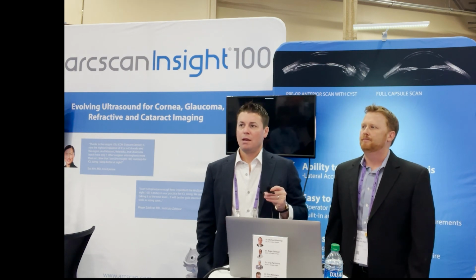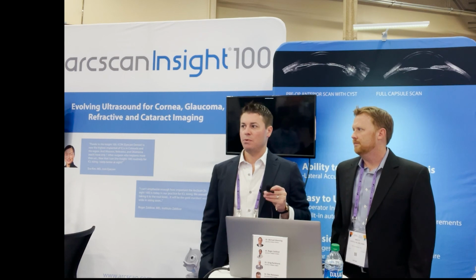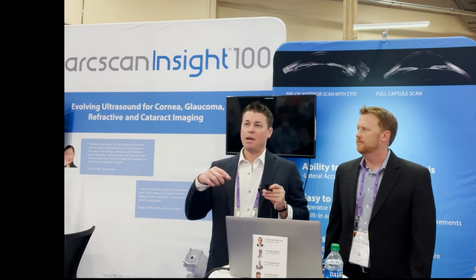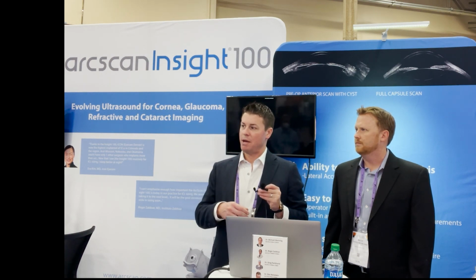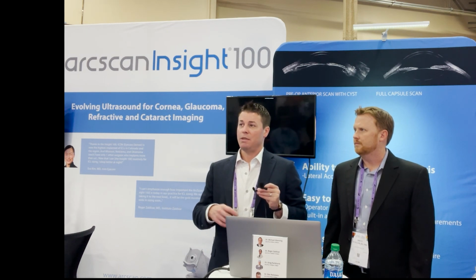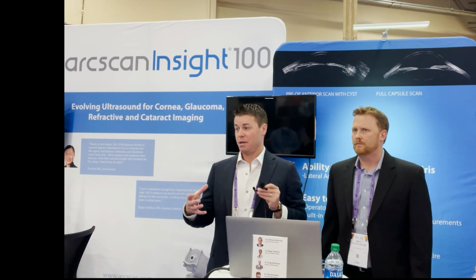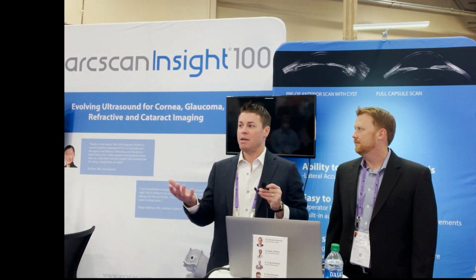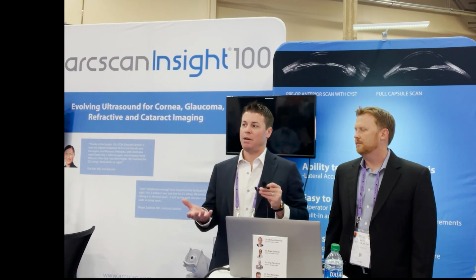Yeah. Just with our prior experience using UBM compared to what the white to white would predict, we have been for years using a different lens based on a UBM nomogram about 40% of the time. It's not a small percentage where the UBM is guiding the placement of the ICL size we're going to pick. And it got to the point where we basically stopped even paying attention to what the white to white was. We were using UBM as our primary sizing data.